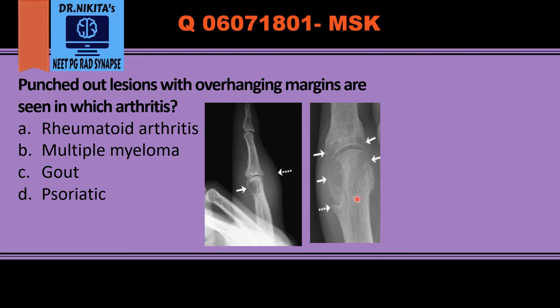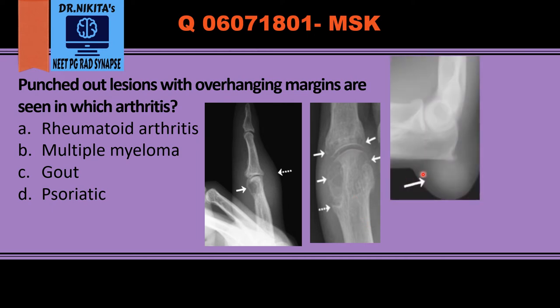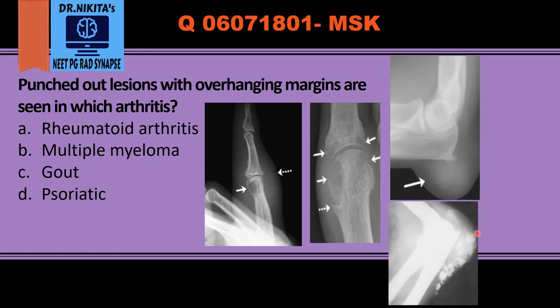This is a lateral radiograph of the elbow showing the olecranon bursa, where we see olecranon bursitis. In chronic stages we might see a calcified tophus.